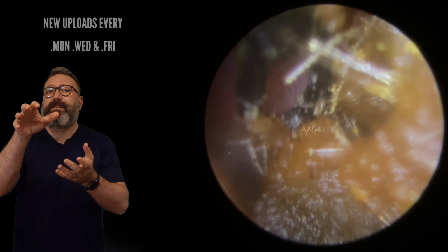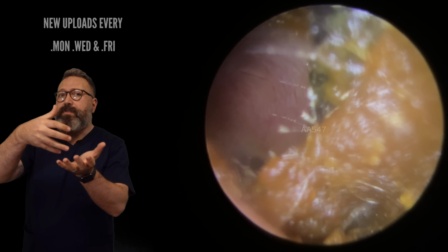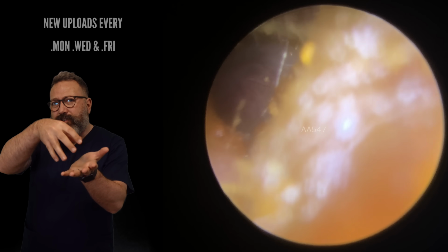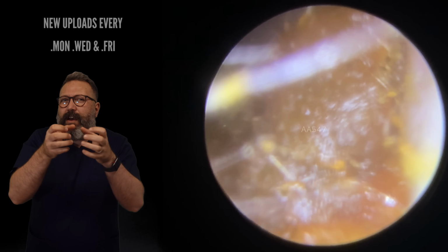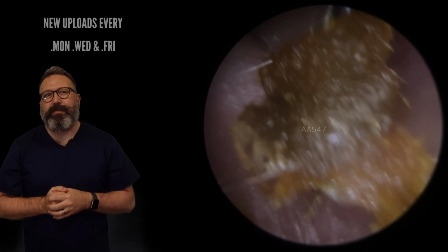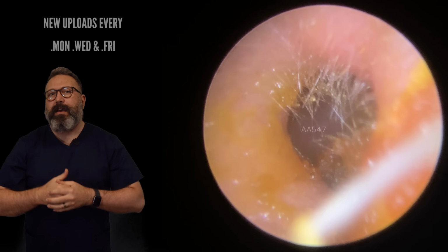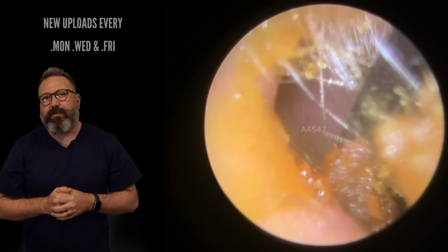Right, now I'm going to try and get to this back section, but because it's soft and squishy, if we pull straight through, it's going to rip it all forwards and then just tear a hole straight through the middle of it. So let's just gently touch on this and try and use that tougher surface of the wax against itself and draw this down. And look at the size of that piece when you do that. So you fold it all into itself and then scoop around the back and bring this forwards. There you go. It's actually dragged the next section forwards here as well.